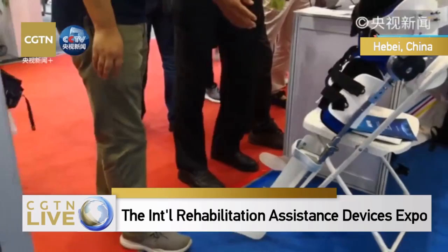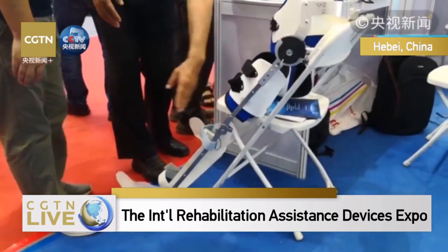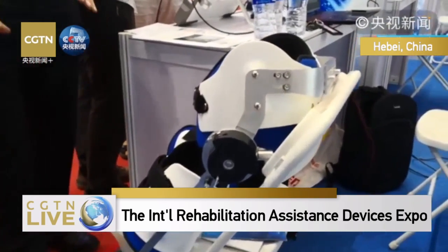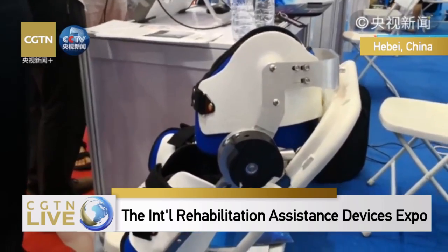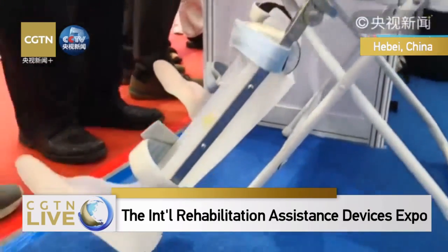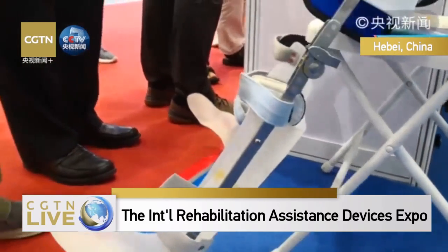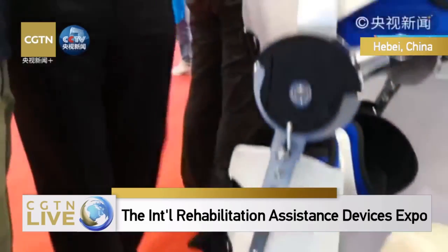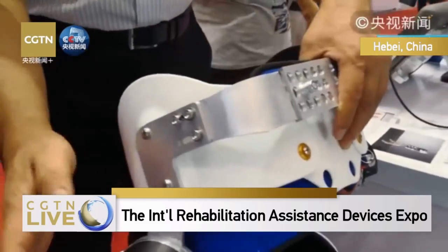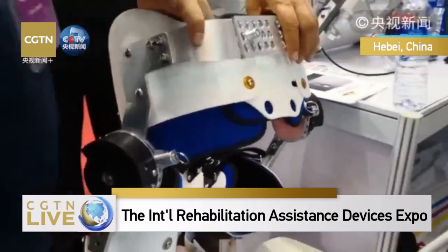And at the exterior, there will be a device that is similar to a skeleton, that is known as the exoskeleton, using sensors and motors to help someone to walk. So it does not need external assistance.